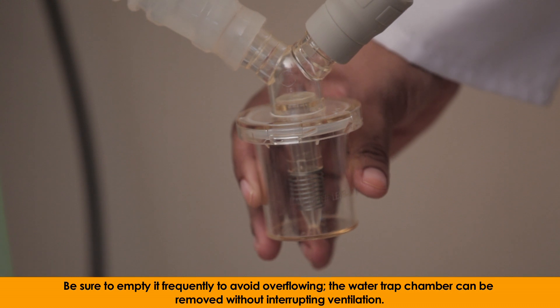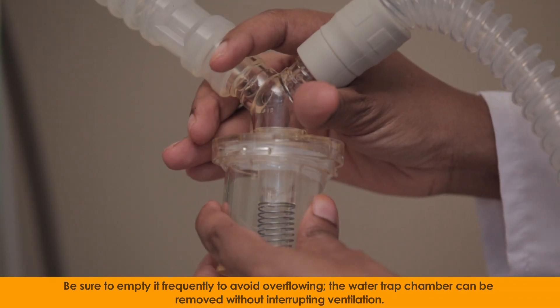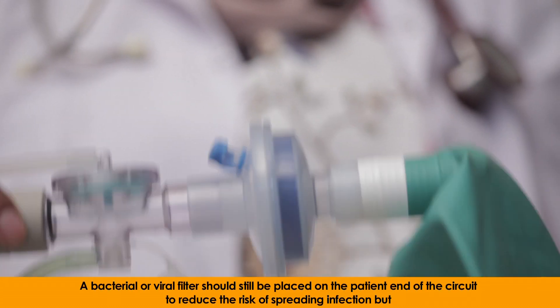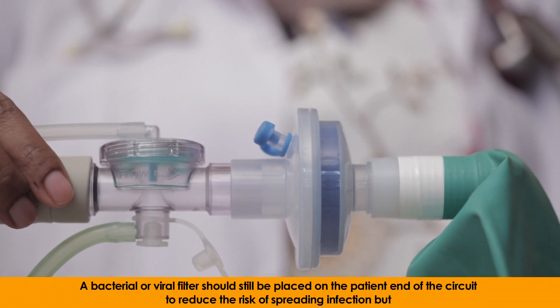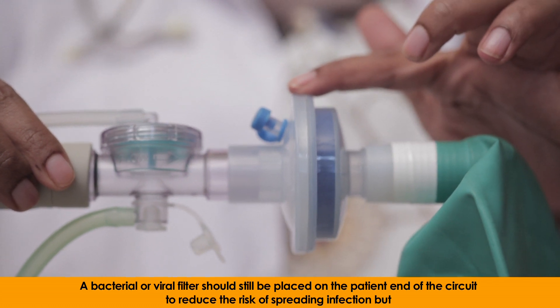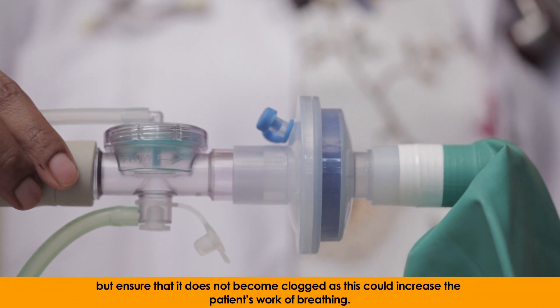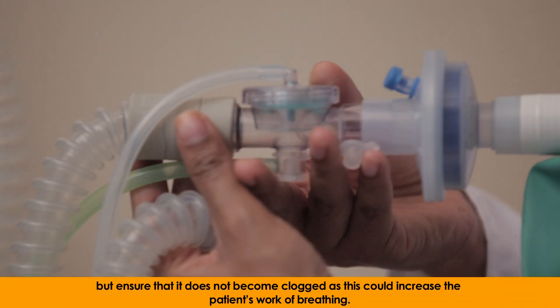The water trap chamber can be removed without interrupting ventilation. A bacterial or viral filter should be placed on the patient's end of the circuit to reduce the risk of spreading infection, but ensure that it does not become clogged as this could increase the patient's work of breathing.